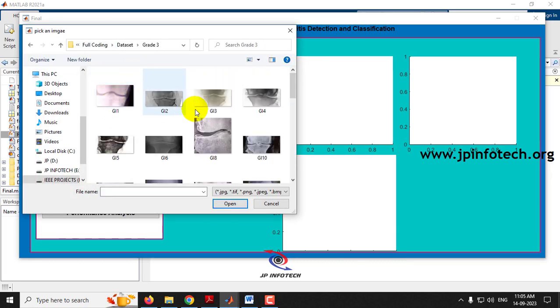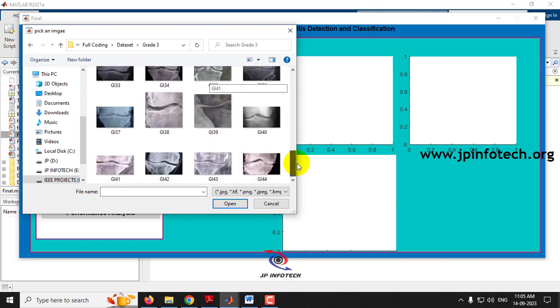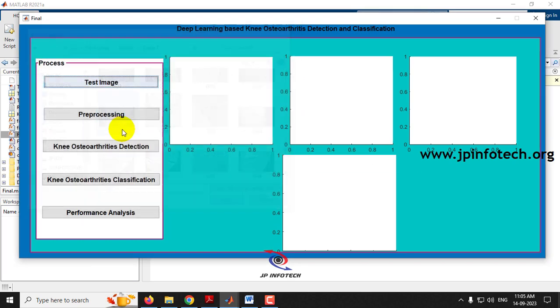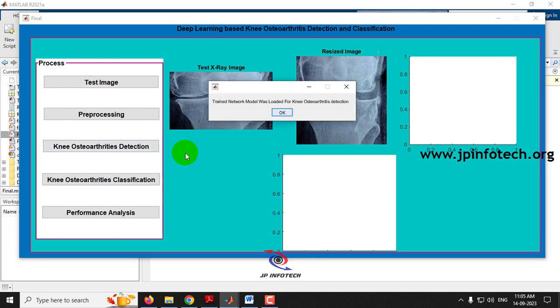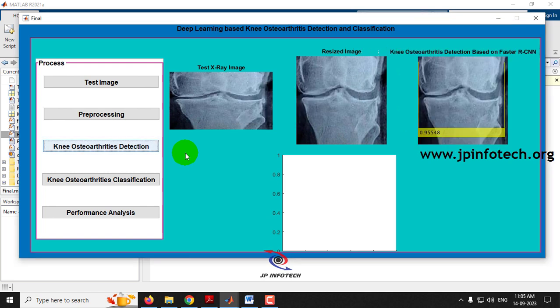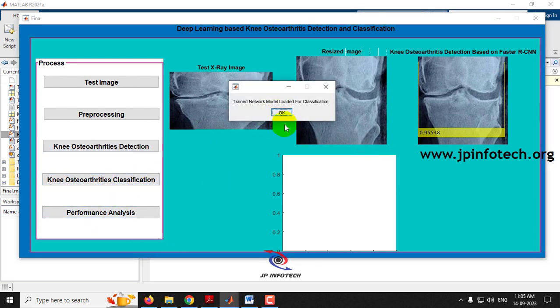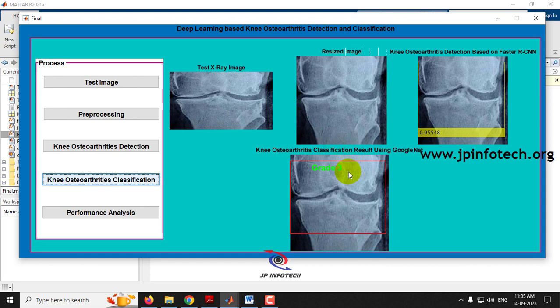Now let me go to the grade 3 images and select one randomly. Go for pre-processing — this is the resized image — then the detection part. You can see the detected result using Faster RCNN. Going to the classification part, you can see it is correctly classified as grade 3.